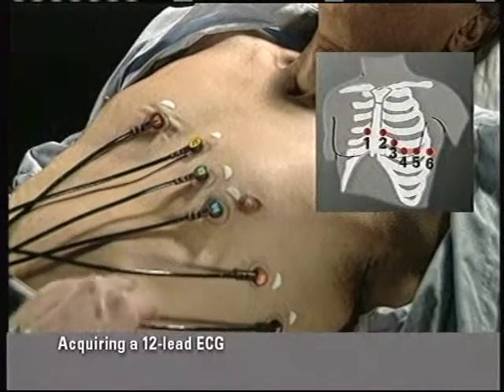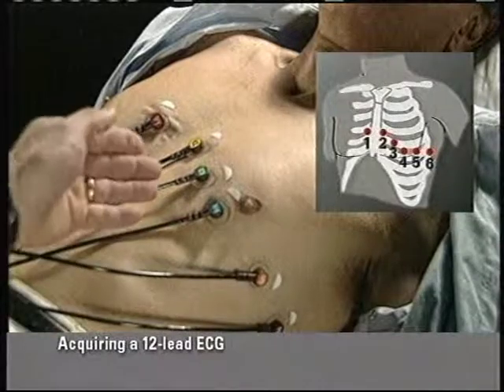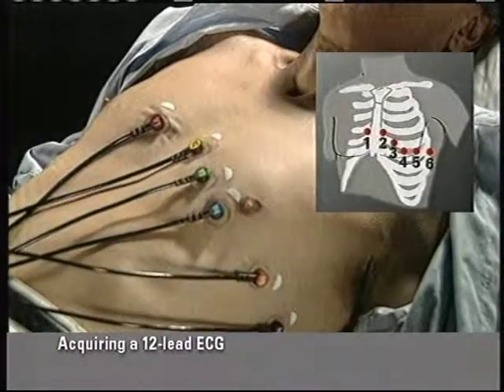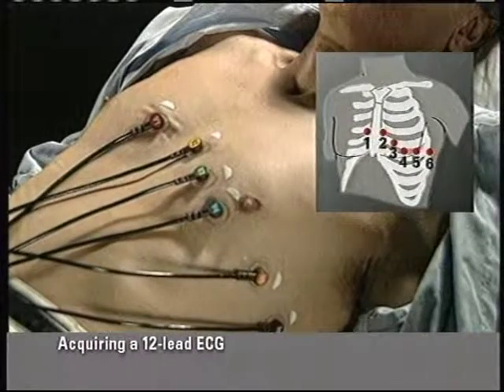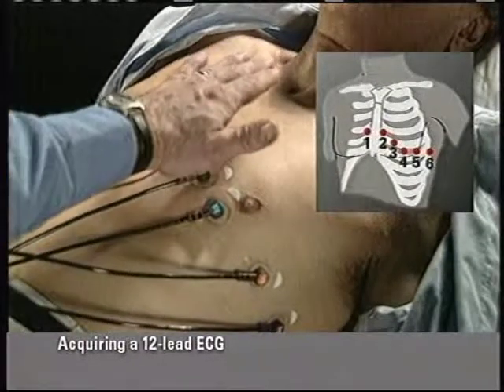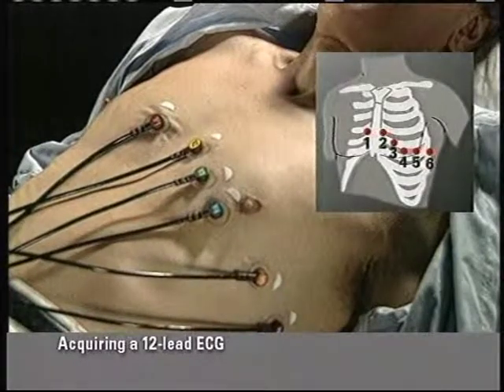When performing 12-lead ECGs on female patients, place the electrodes for leads V3 through V6 under rather than on the breast. Once all the electrodes are applied, encourage the patient to lie still. It will take a minimum of 10 seconds for the monitor to acquire a 12-lead ECG.